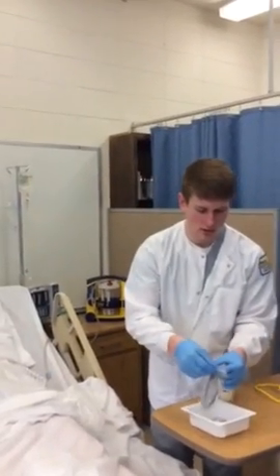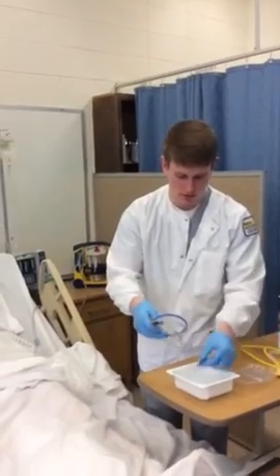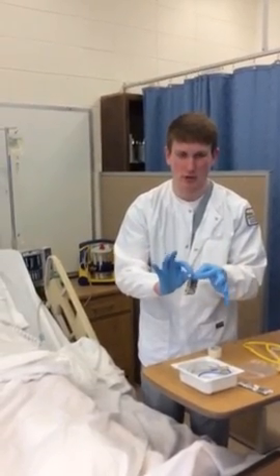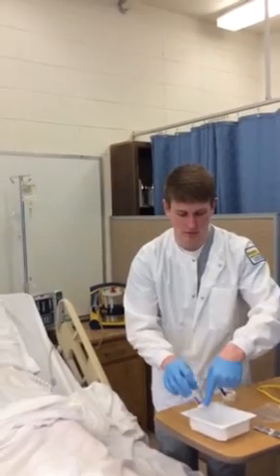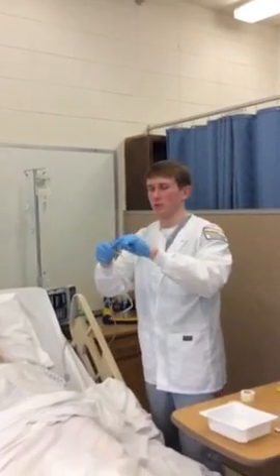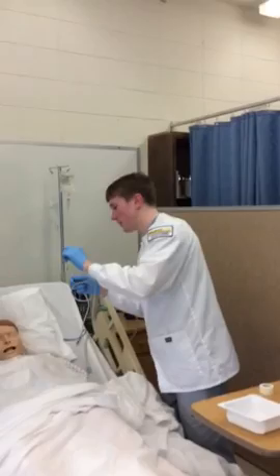Okay. I'm going to take the tube out of the package. I'm not going to open these just for the purpose of the video, but I'd break open my lube, squirt that down into my little basin I've got going here, and then measure the tube from the tip of the nose to the earlobe to the top of the xiphoid process.